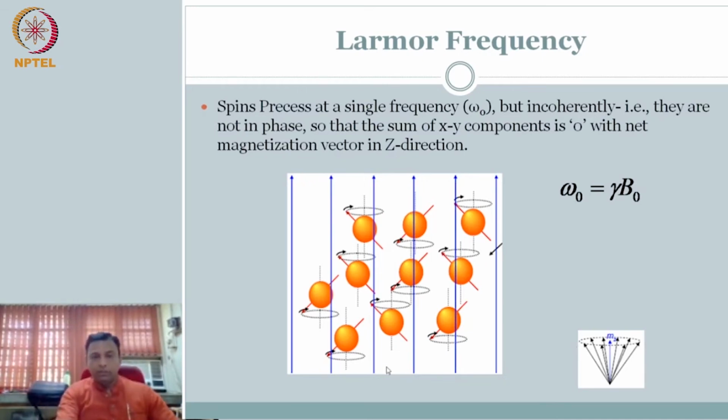So this is what it is. The blue arrow that you see is the external magnetic field, right? Each one is spinning at different orientations. When you apply the external magnetic field, they all try to align, and you can relate this to the different hands where each would have stopped. So these are spinning around, and there is an Mz.